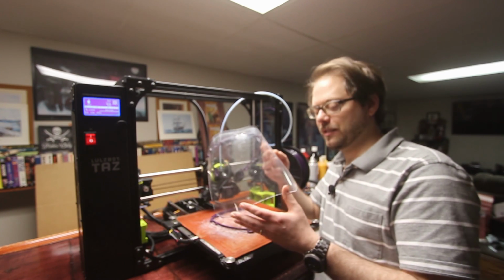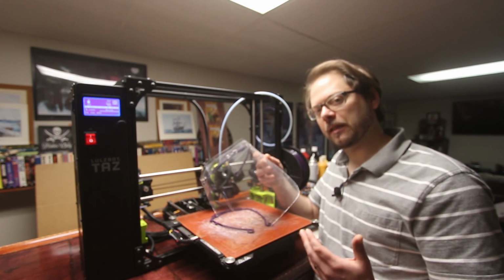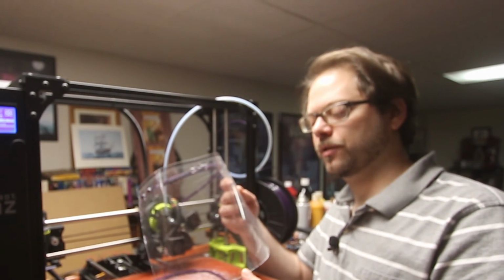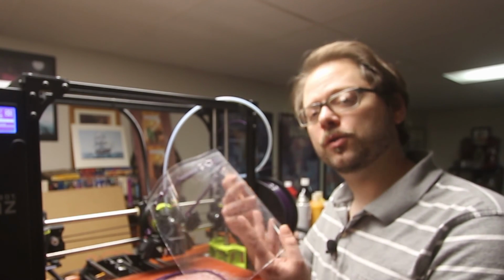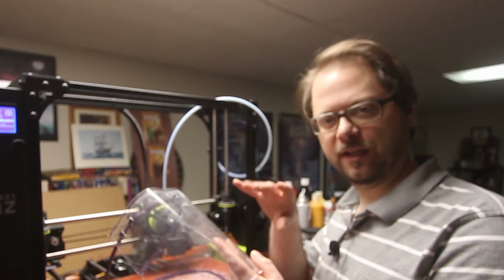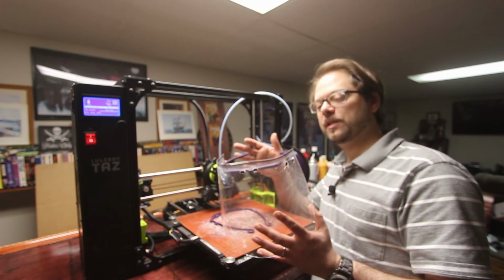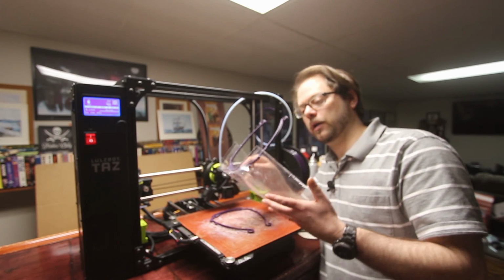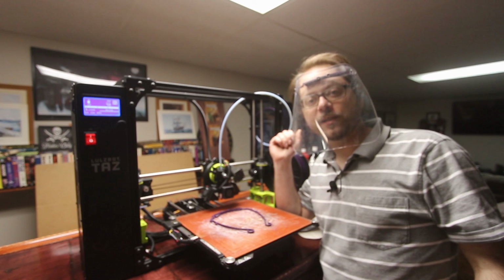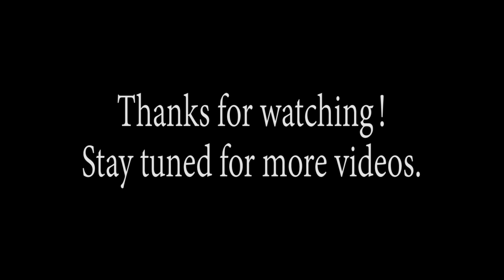If I had to continue using this type of plastic, I would probably do kind of like an assembly line type thing where someone would cut out the plastic with scissors and then they would hand it off to someone that would use a Dremel to buff the edges smooth to get rid of any chips or cracks or anything like that. But other than those issues that we will work on adjusting, the 3D printed face shield was a success. So, great news. Thanks everyone.